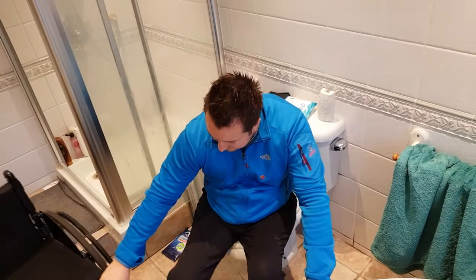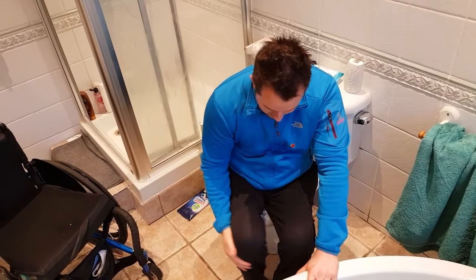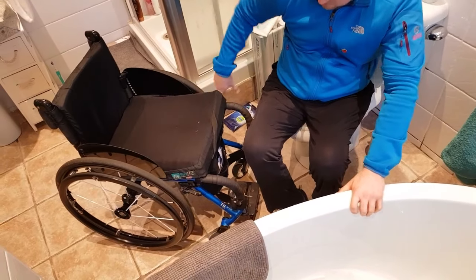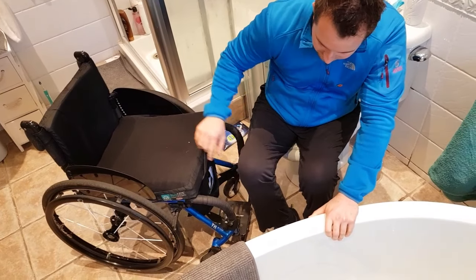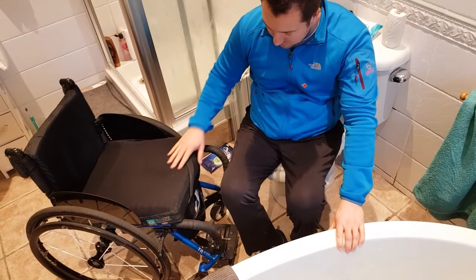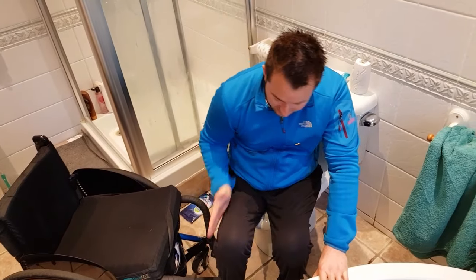To get back off it's just really a reverse. I shuffle myself slightly to the left of the toilet seat, bring the chair up, and lock the brakes. At this point I'm not really too fussed about the casters being forwards because there's enough stability for me to do what I need to do and transfer back on again. I put both my feet out in front of me.